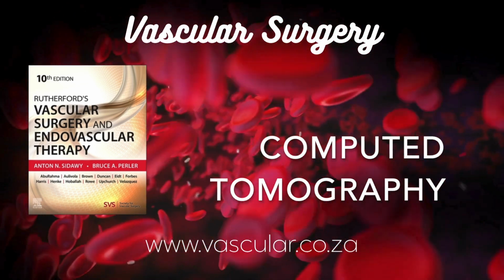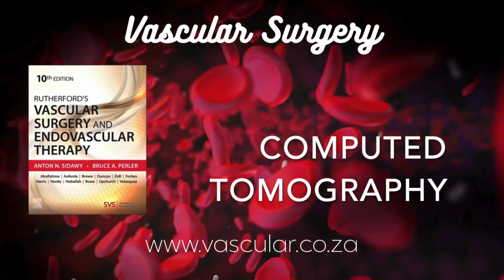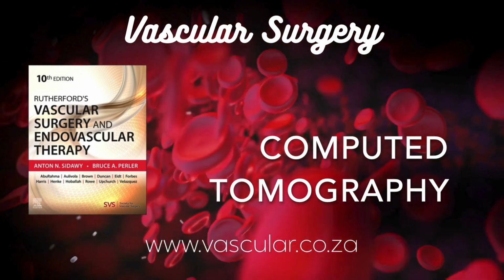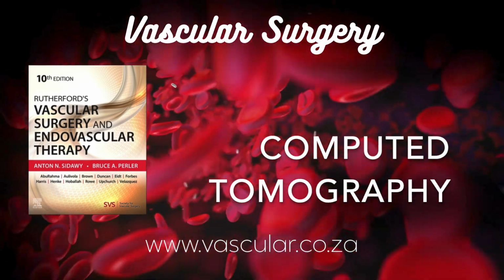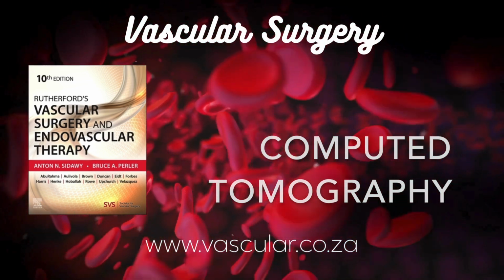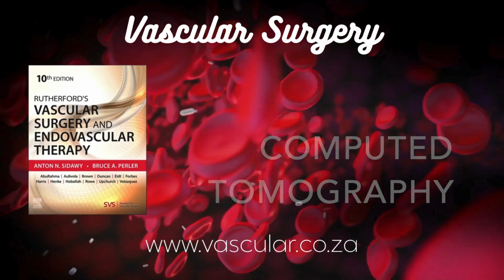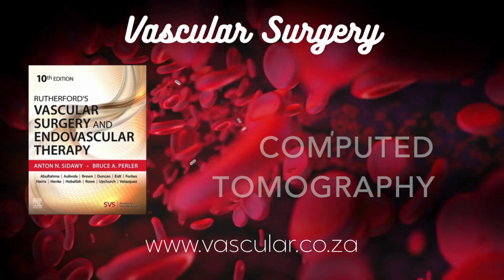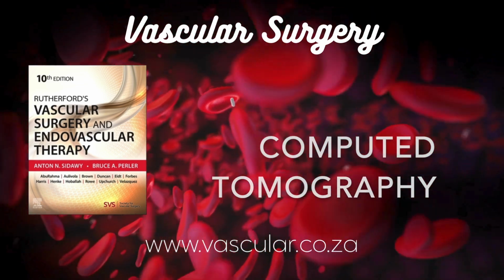The massive benefit is noise reduction. IR algorithms can reduce image noise by 70, 80, even 90% compared to FBP without sacrificing spatial resolution. Wow. So you can get sharp images and low noise. Pretty much. Or, the really exciting part, you can deliberately acquire the initial data with a lower radiation dose, which would normally be too noisy with FBP, and then use IR to clean up that noise, effectively achieving a diagnostically good image at a significantly lower dose to the patient. That's been a major driver for adopting IR. That's a huge win for patient safety.